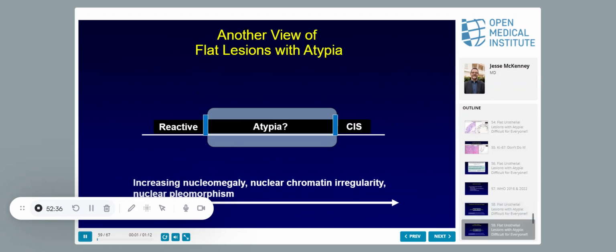is I call all these atypia of uncertain significance. And the reason is that for dysplasia, nobody knows what the natural history is. The urologists don't know what it is. It's completely not reproducible. If I picked 20 cases and sent them around to whoever you wanted in the world, who you thought was a good bladder pathologist, the diagnoses would be all over the place. I'm not okay with that. If we have that much variation amongst experts, then we should just lump them all into the we-don't-know category. So that's what we do.